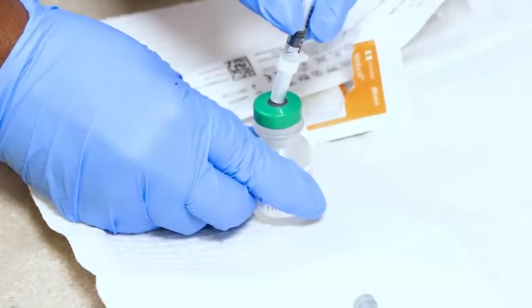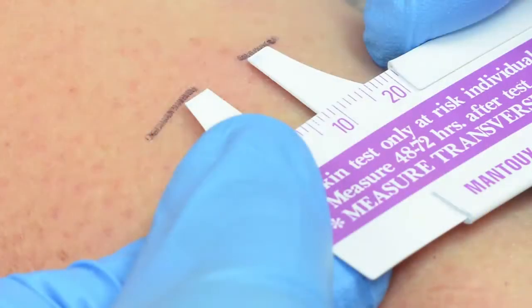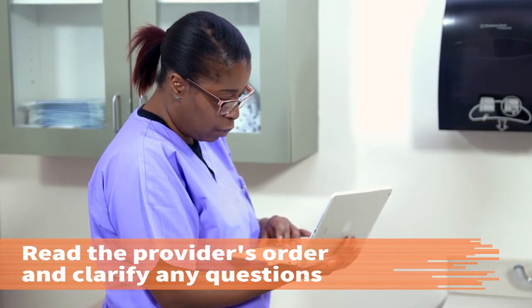In this procedure, you will learn how to administer an intradermal injection and read a tuberculin skin test. Read the provider's order and clarify any questions with the provider.